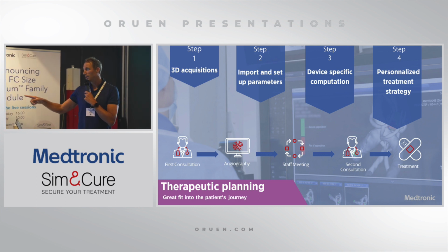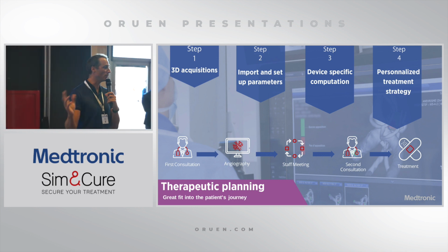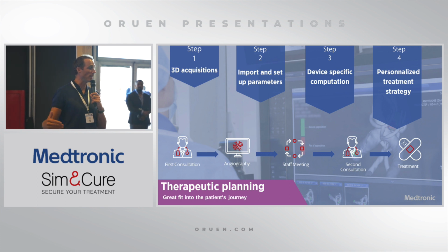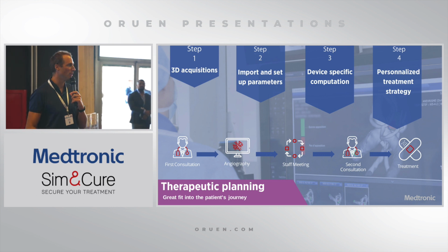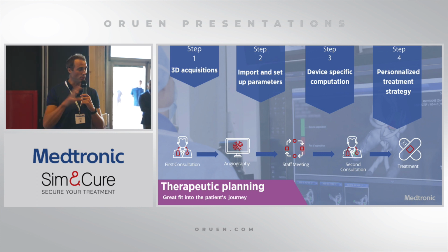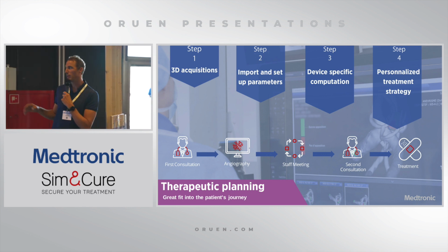We also use these simulation tools to discuss cases with the whole team. So we have a staff every week where we see all the aneurysms, the elective cases. And in 3D, we are moving the aneurysms, we are testing different devices, and people are giving their opinion to make the best decision for the patient. So it's also a tool of planification, of consultation, of multidisciplinary decision, because the surgeon also is looking at what we are doing. So interface with the patient, interface with the other partners of the team to make the decision.